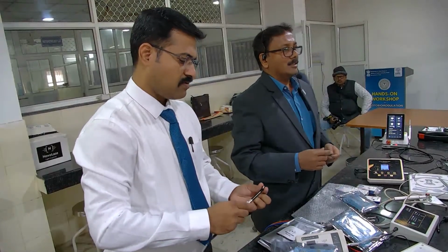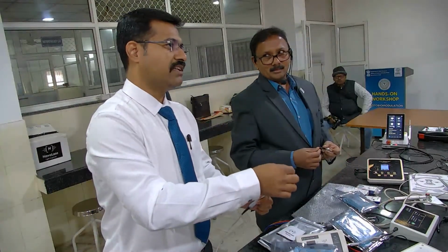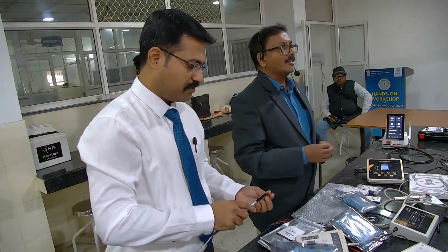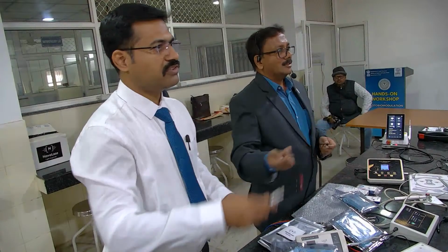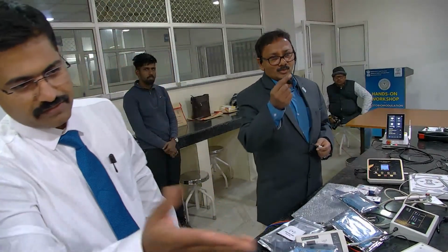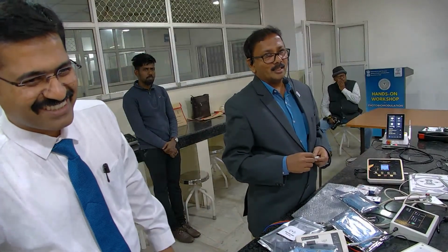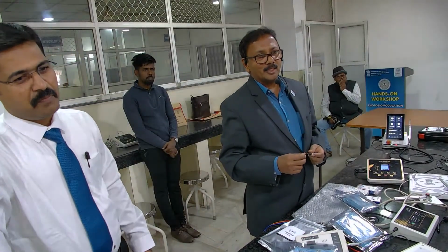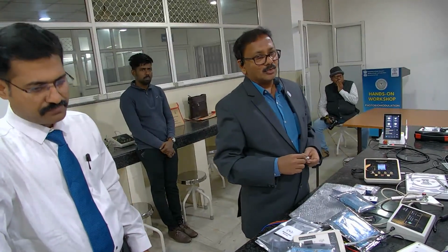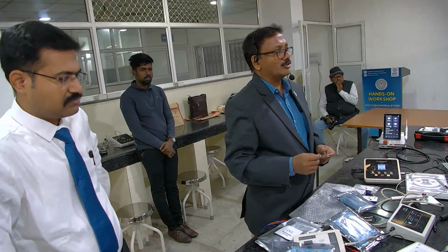How to use it? You will be having those RVG sleeves, no? You can use it until it wears out. You can use it for an average of 3 to 4 patients per tip. So if the cost is around 500 rupees, you can use 150 rupees per patient.